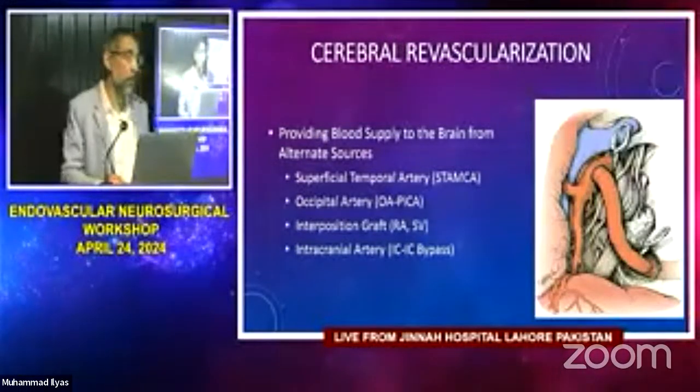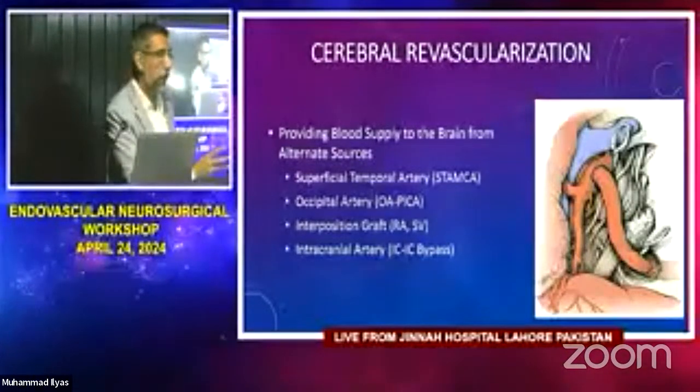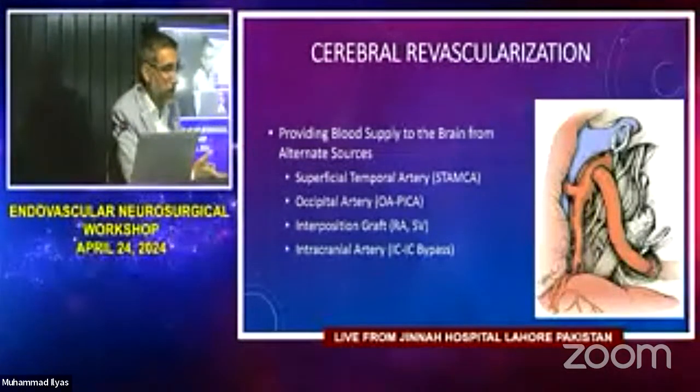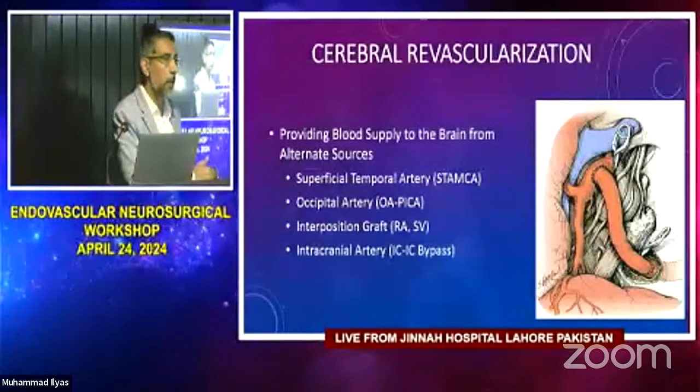Right, so very good question. Routine stents. In neuro, we have predominantly three types of stents. One is the one that you use for stent-assisted coiling. An example of that is an Atlas stent that Stryker makes, or the LVIS Junior stent that MicroVention makes. They are just open cell stents.